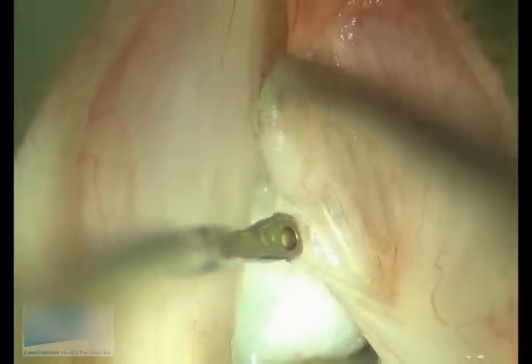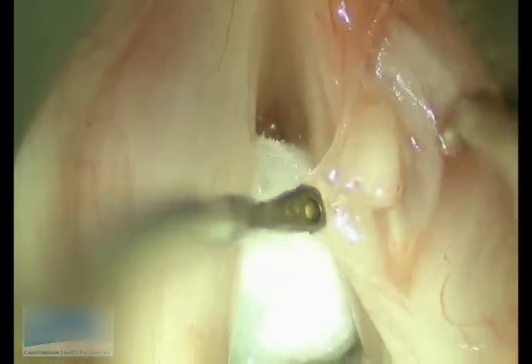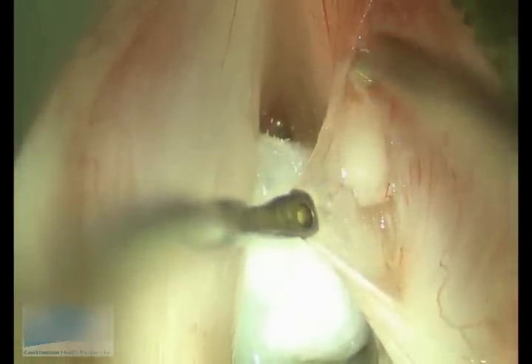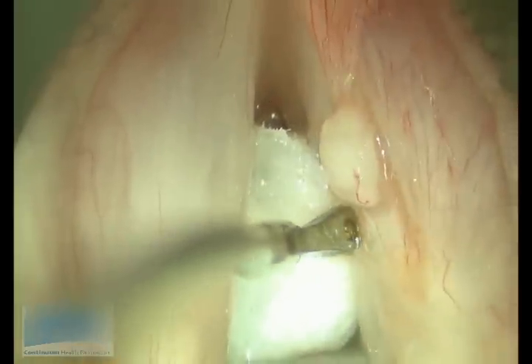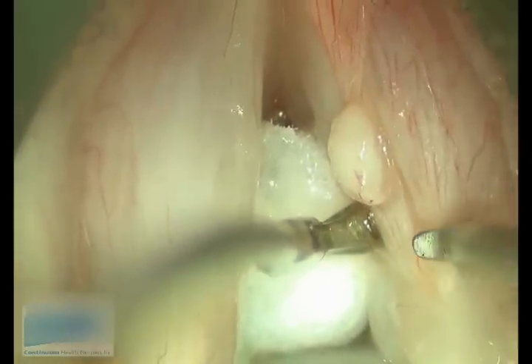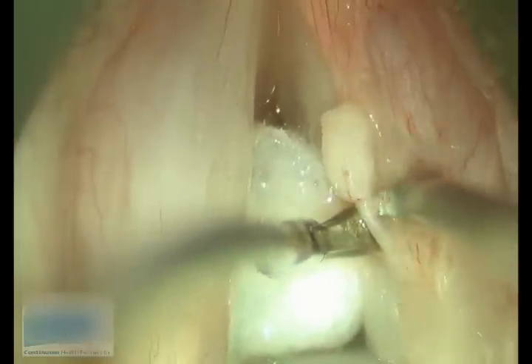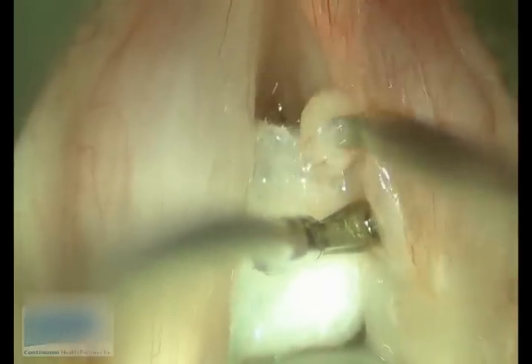As the dissection continues, the cyst is isolated from all its surrounding tissue. The last fibers which adhere the cyst to the underlying flap are transected.